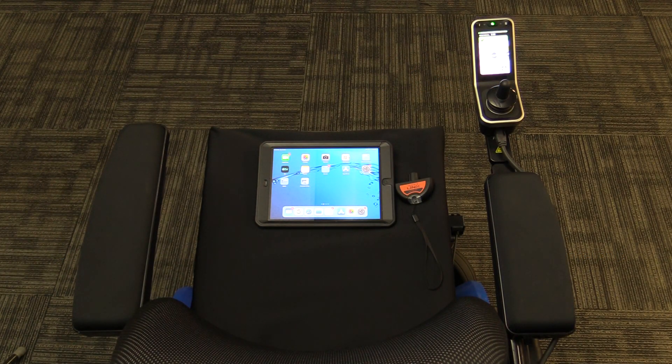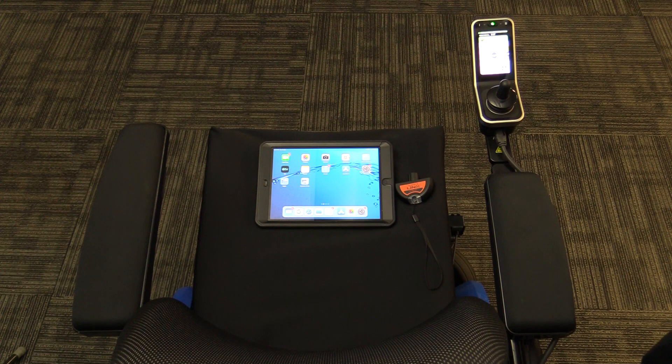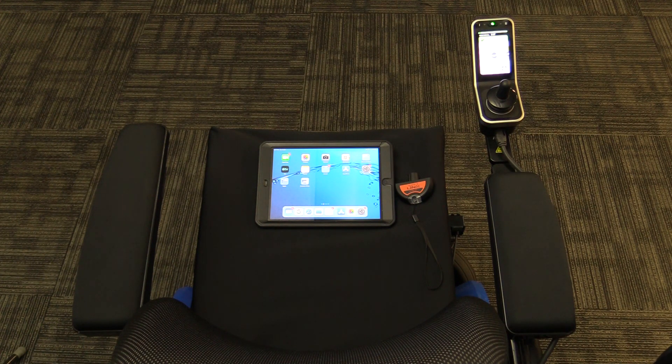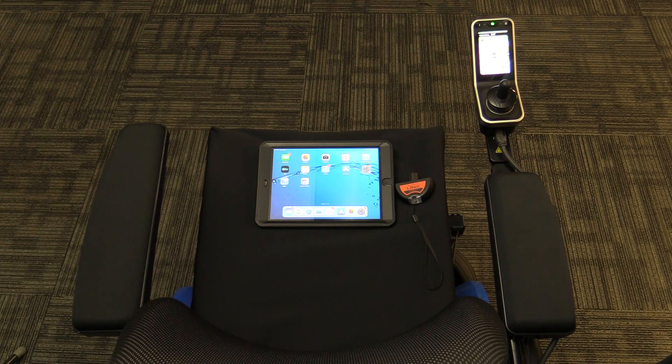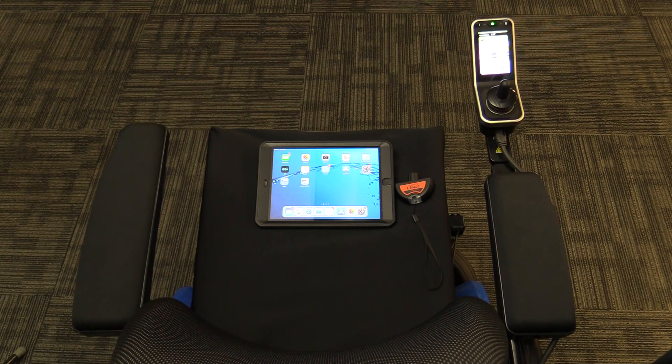In this video, we will be showing you how to connect and program the Invacare Lynx electronics using the Lynx app on an Apple device.